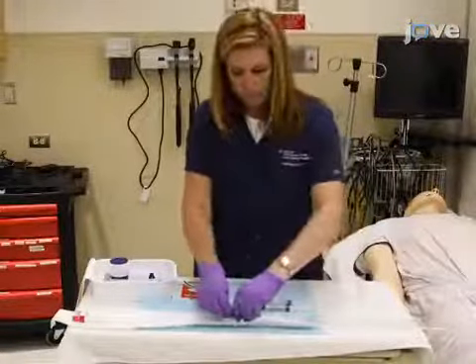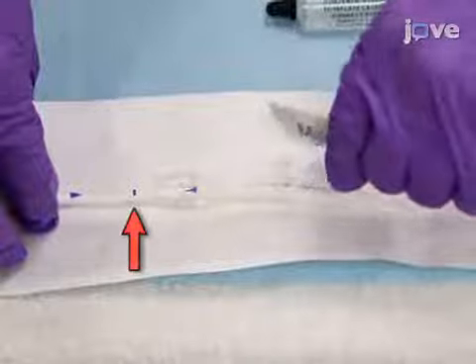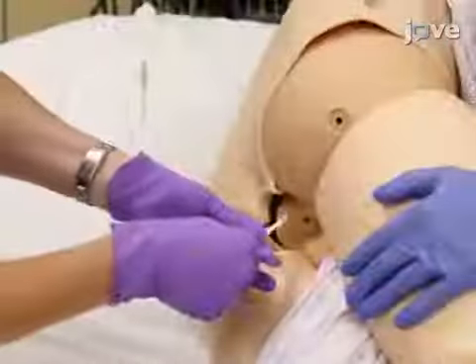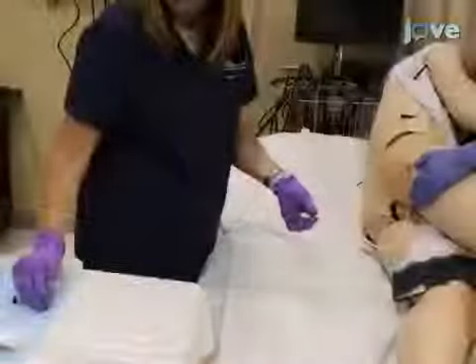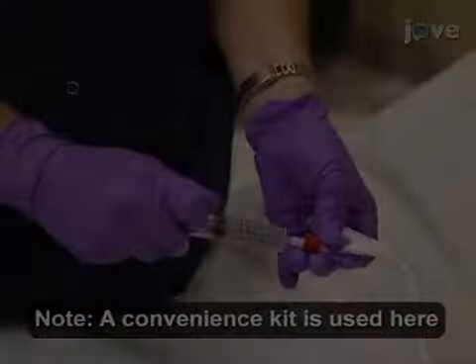If the device can be used, then first lubricate the catheter from the tip to the blue marker line with a water-soluble lubricant. Then, insert the catheter into the rectum to the blue marker line between the two blue arrows. Next, inflate the balloon using a Luer syringe by injecting 15 milliliters of water.